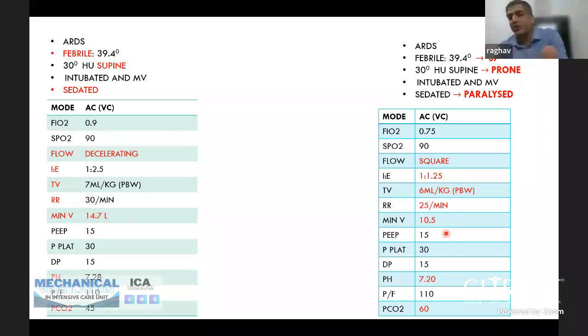Though the CO2 production was decreased by other maneuvers, still the patient's PCO2 rose from 45 to 60, and we were not bothered because permissive hypercapnia should be allowed in ARDS. A pH of 7.2 or PCO2 of 60 is not harmful, but a high mechanical power delivered to the patient is harmful. So we don't have a particular threshold for mechanical power, but with various maneuvers we can try to reduce the mechanical power delivered to a patient and thus reduce the mortality and ventilator induced lung injury.